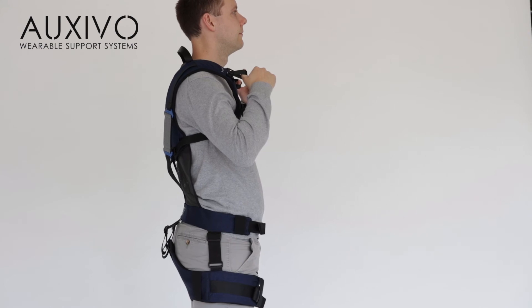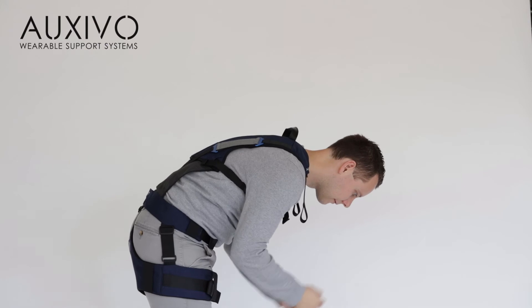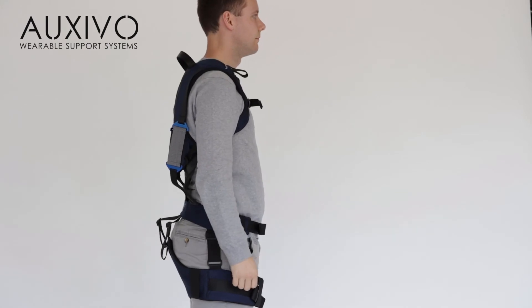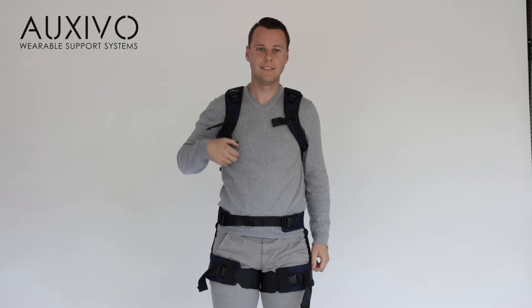A good way to get started is to test the support the lift suit provides you. One way is to activate the suit, lean forward and release the support. You will feel your muscles abruptly stabilising your upper body. This is the level of support that you can expect from the lift suit.